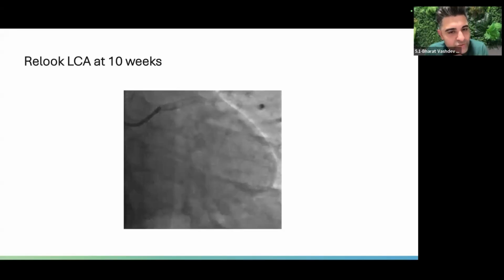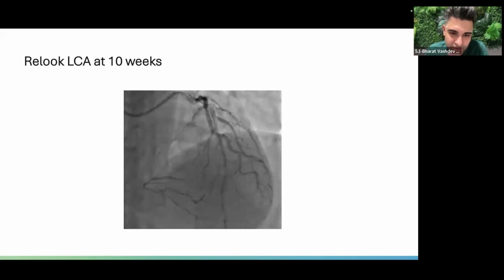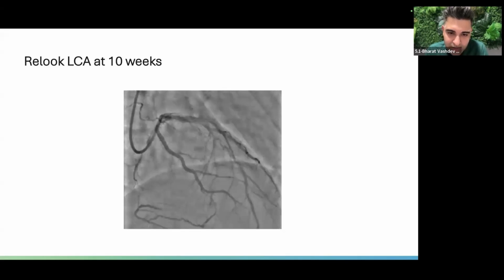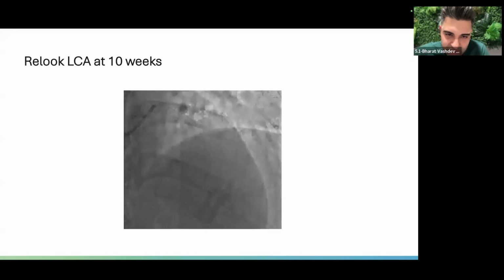And I've also done some electron microscopy work to show there's no real polymer damage. So that I will follow up with the second publication. But I'll send you the manuscript. It's just a very small, I think it was 500 words, for AsiaIntervention.